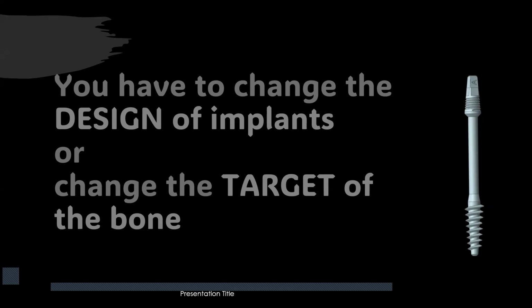And if the design cannot become narrow, that means if we want to place that wider implant into the patient's mouth, we need to place it by giving incisions, by doing multiple osteotomies rather than a single drill osteotomy. So when we are indulging in any surgery, we also need to take care of the sugar, BP, and other medical conditions of the patient, because if the patient has a high HbA1c, again it becomes a limitation for us.